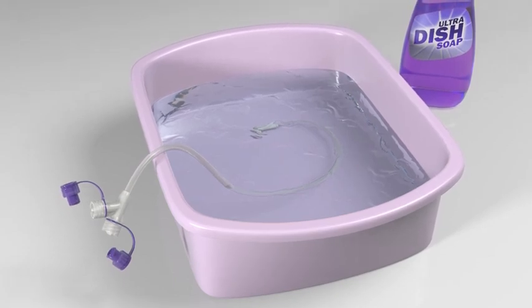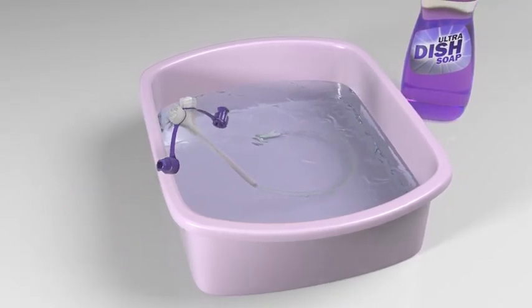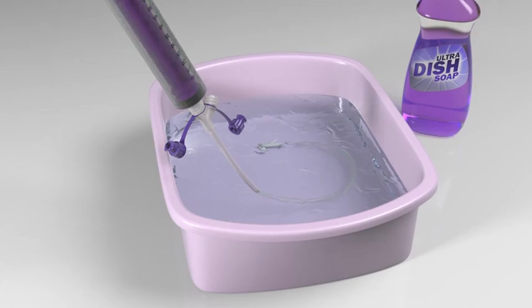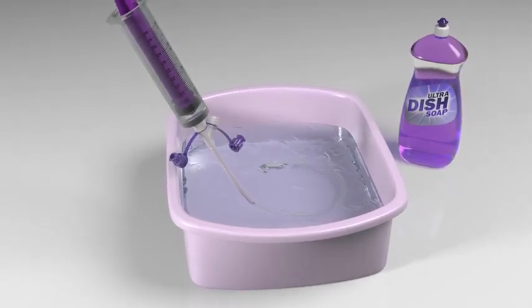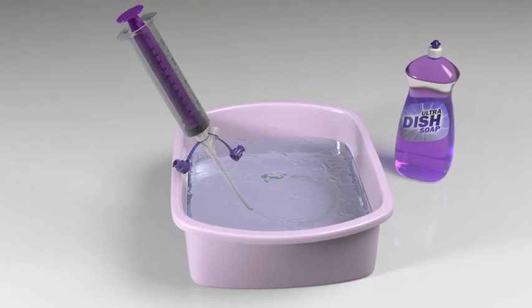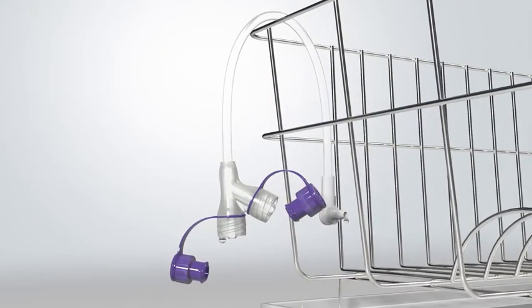Place one end in warm, soapy water. Attach a syringe to the other end. Pull back on the plunger several times to move soapy water through the set. Rinse and hang to dry.